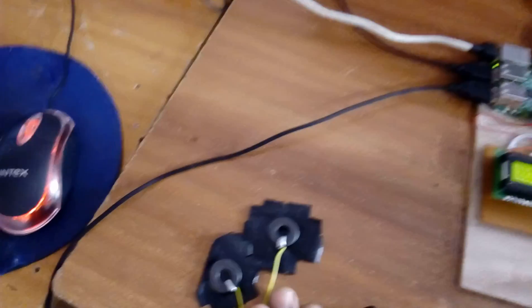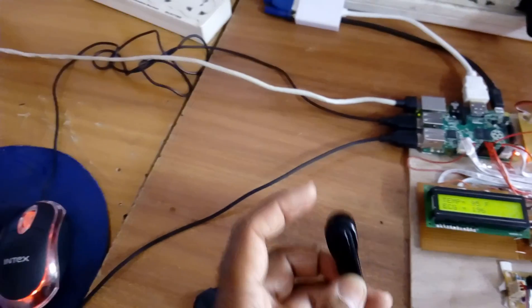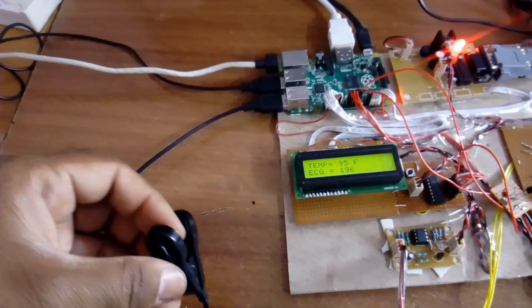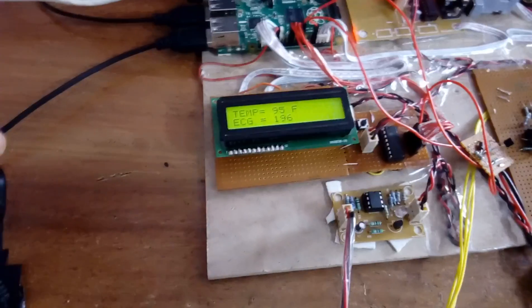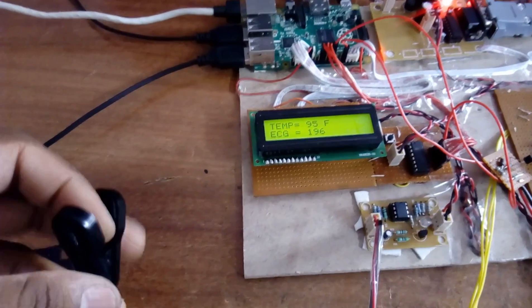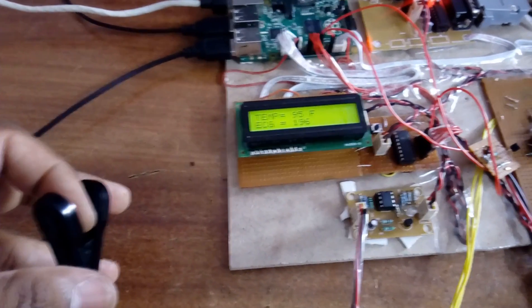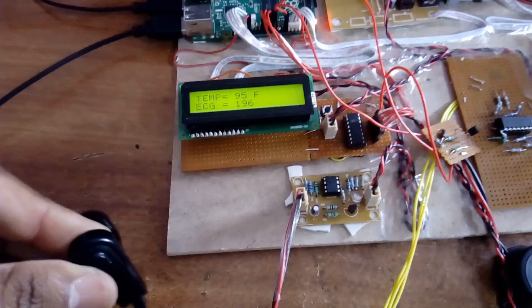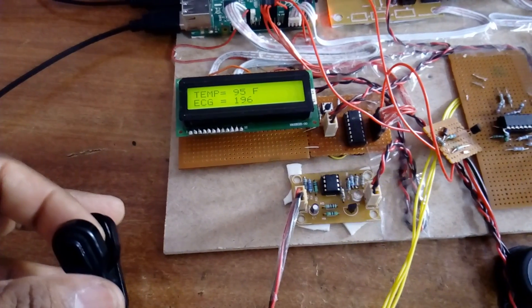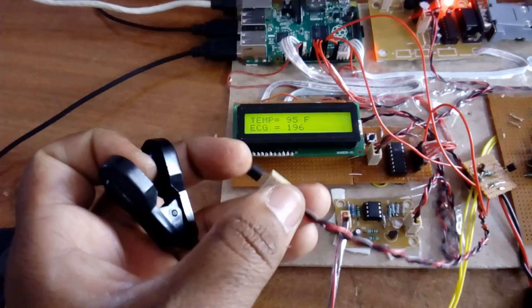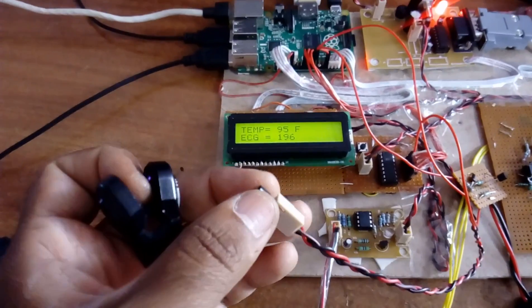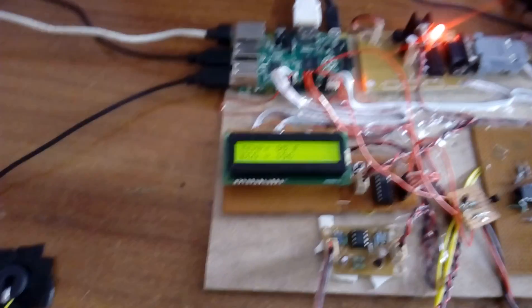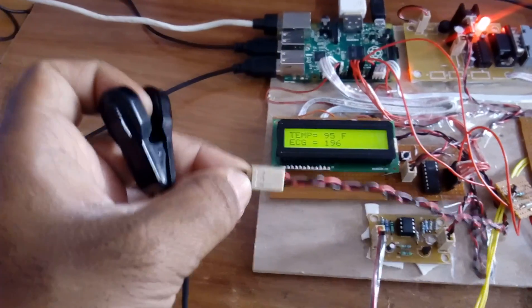You can connect the probes correctly to your left hand, right hand, and one left leg. You can keep this finger onto your fingerprint. Once the fingerprint is kept, the LED will blink. You can check it out.